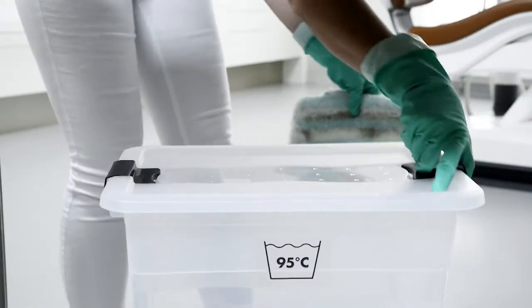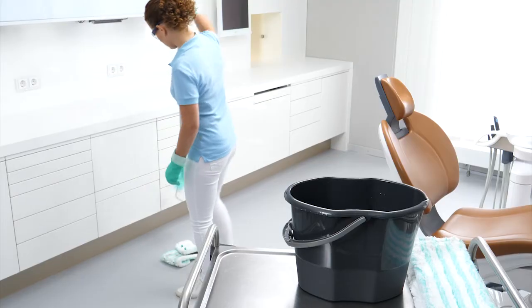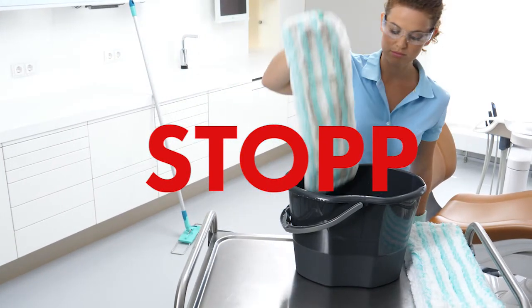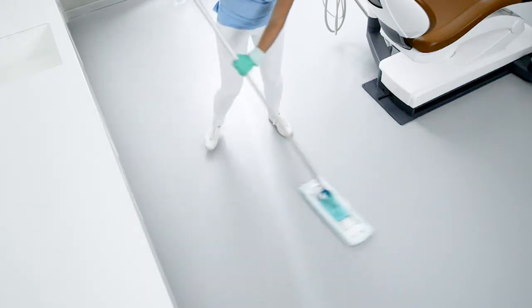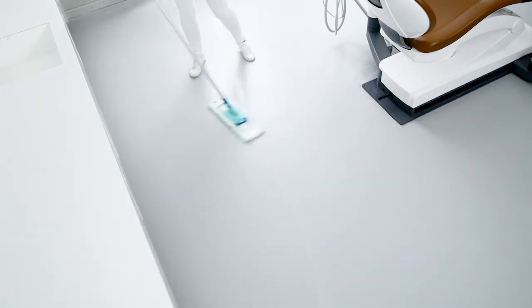After wiping, throw the used mop cover into the reprocessing bin. This procedure is also known as the cover change method. Never re-immerse used wiping cloths in the solution. This so-called one pail method leads to contamination and inactivation of the disinfection solution. In the classical cover change procedure, the superfluous liquid is absorbed by the new cleaning cover in the second step.